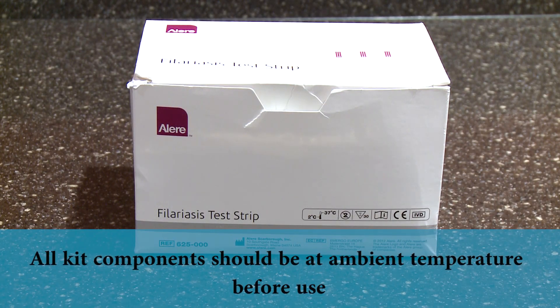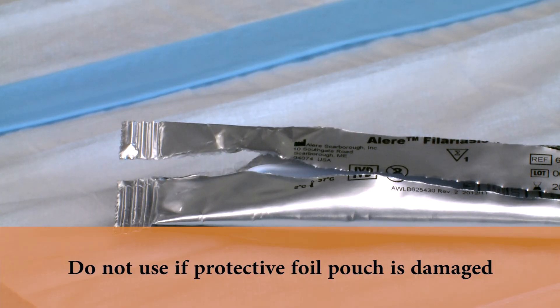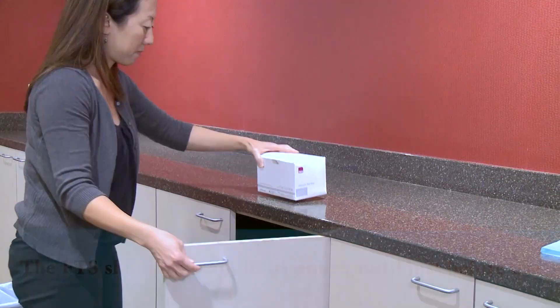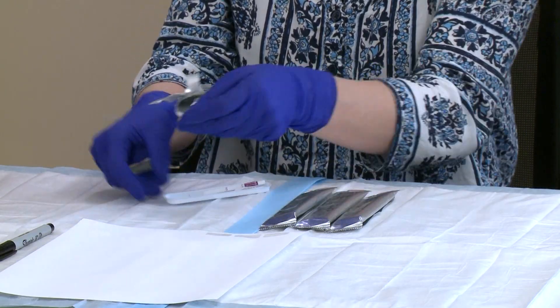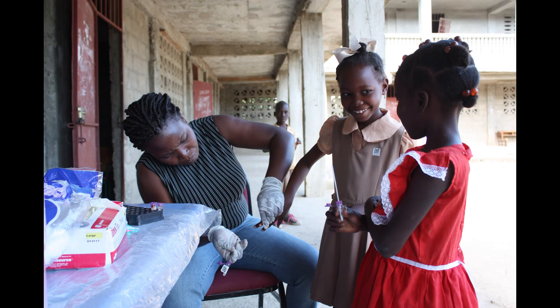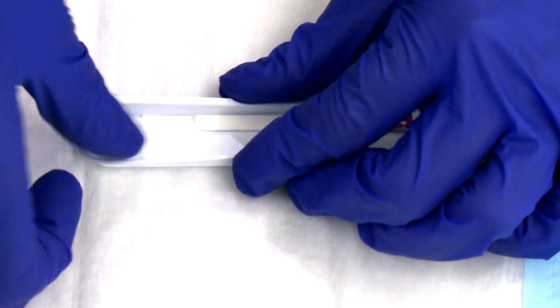Kit components should be brought to ambient temperature, 15 to 37 degrees Celsius, before use. The test strip should not be used if the foil pouch is open or damaged. The strip should remain in its foil pouch until just before use, and the storage boxes should be kept as dry as possible. During a survey, multiple pouches can be opened at one time, but be careful not to open more kits than necessary. The number of open kits should not exceed the number of individuals to be tested. The test strip and plastic work tray should remain in the foil pouch to reduce the risk of the strip blowing away. Once the kit is open, it should be used within one hour.